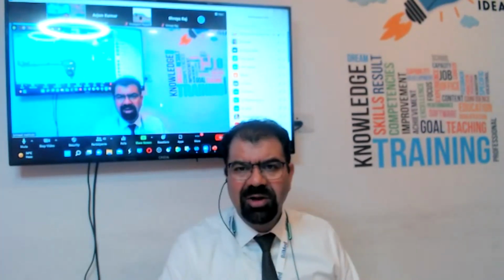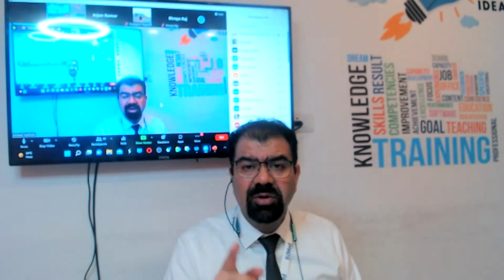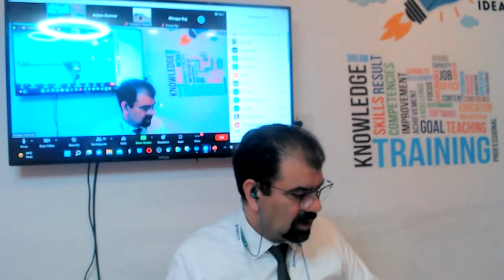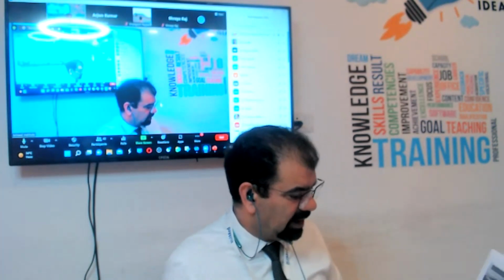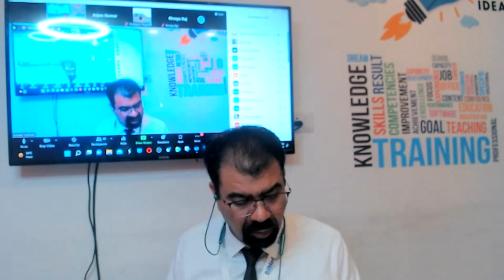Your plane is not appropriate. That is why your ductus venosus will not come, and it will not come until you take a complete mid-sagittal section. So this was a brief explanation. I am very sorry, my explanation is always very lengthy, of Dr. Rishi Kumar's question.